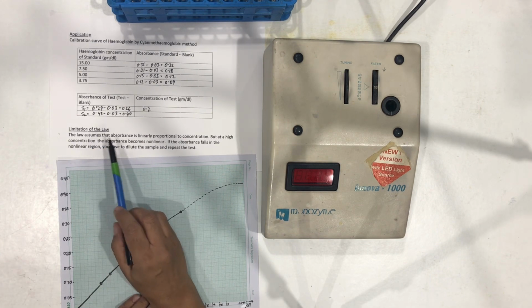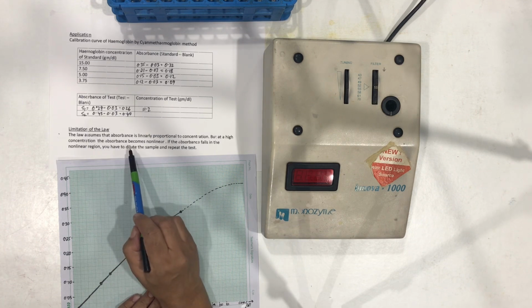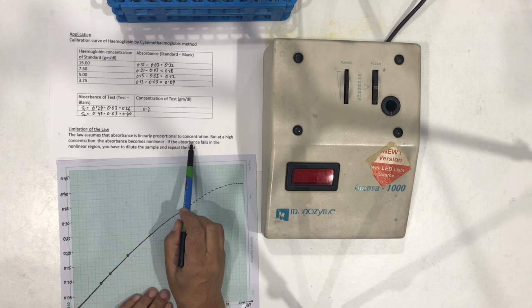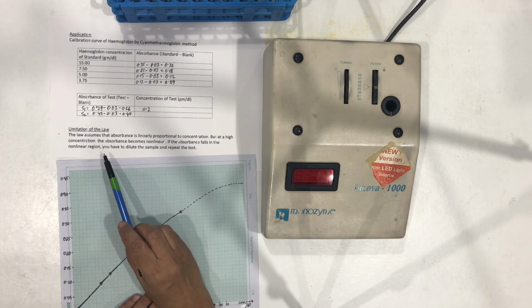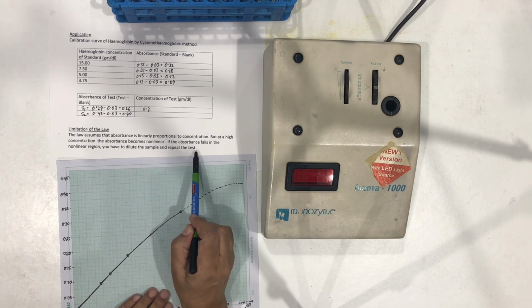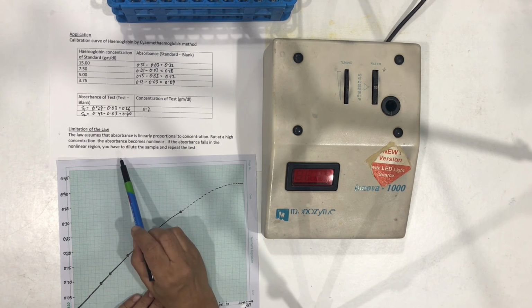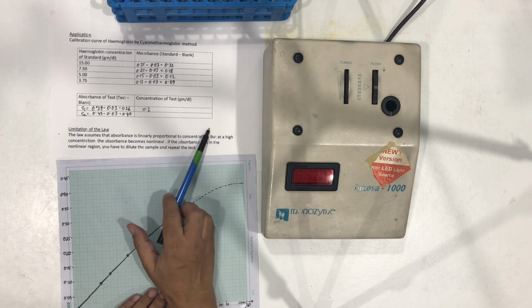Limitation of Beer Lambert law. The law assumes that absorbance is linearly proportional to concentration, but at a high concentration, the absorbance becomes nonlinear. If the absorbance falls in the non-linear region, you have to dilute the sample and repeat the test.